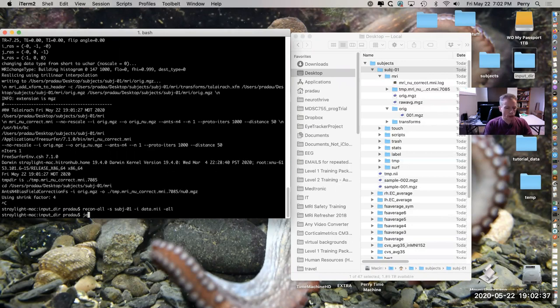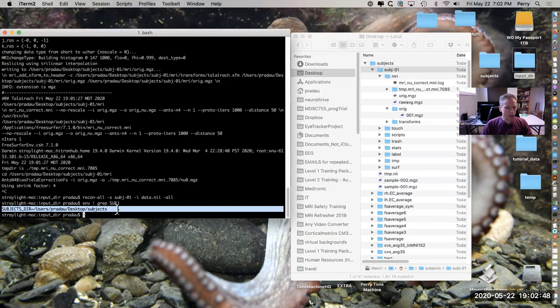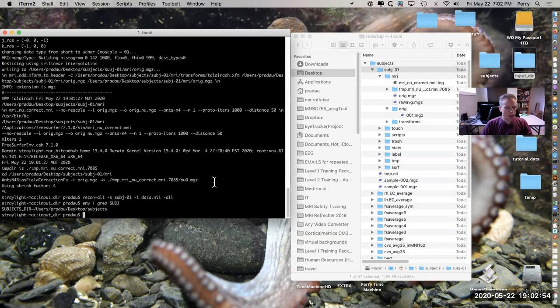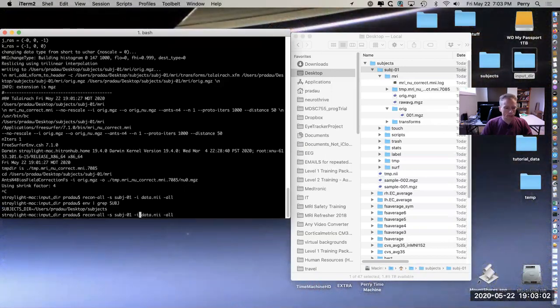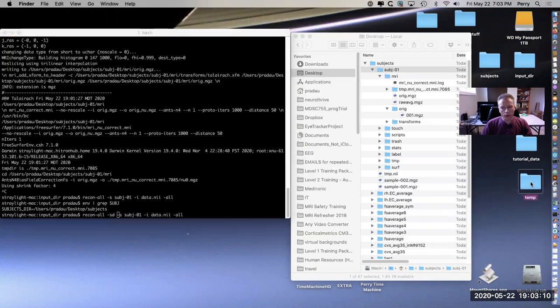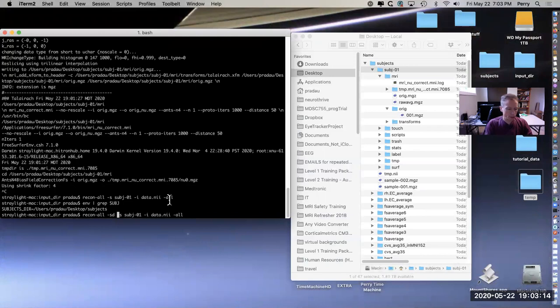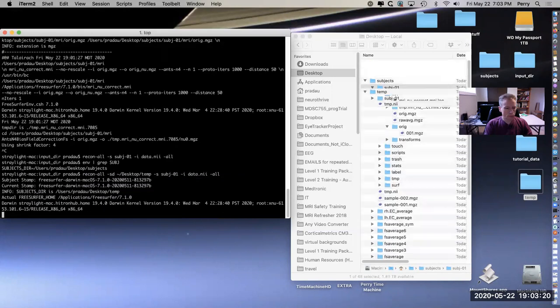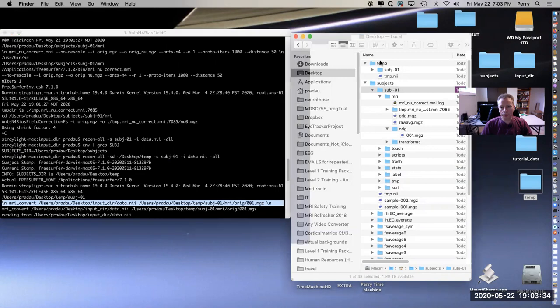If we look at our environment and we look for subject, this is the environment variable that we have set up in bash profile. If I wanted to use a different one because I wanted to keep this project separate from other projects, then I would run this a different way - maybe put it in temp, which I already have on the directory on the desktop. So look, we're converting this data and the initial conversion is creating a file under temp, which you can see here. That's how I can specify on the command line what the output directory will be.